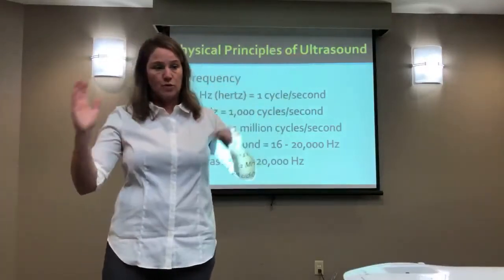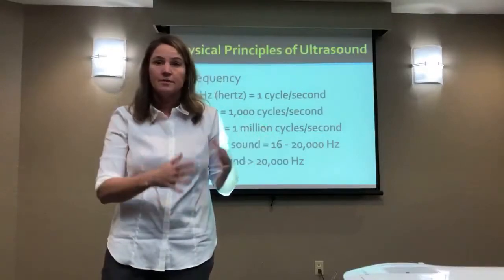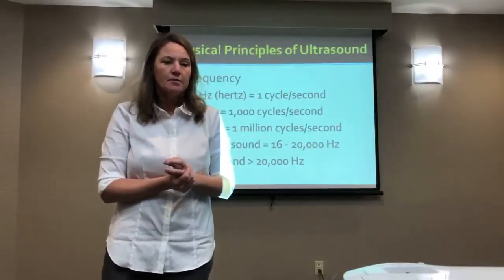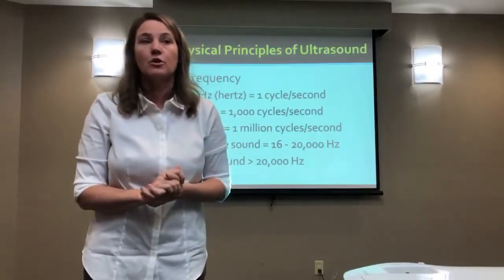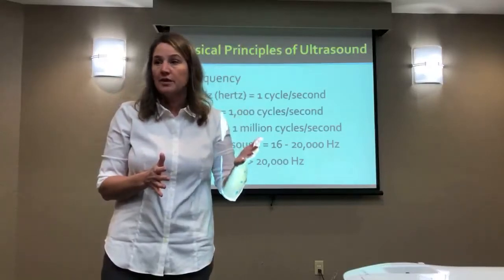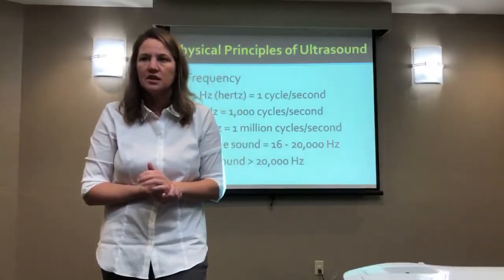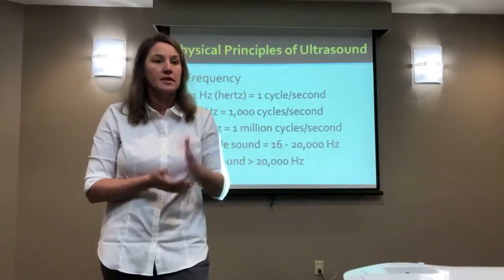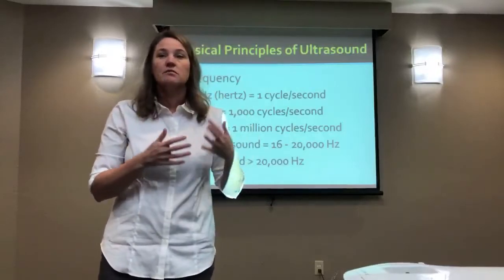So there's a long range. From 20,000 on up is classified as ultrasound. And there's a lot of different things that are done with it. We already talked about therapeutic versus diagnostic versus damaging type energy. So basically anything over 20,000 would be considered ultrasound. So there are devices that are often called low frequency ultrasound. They're in the thousands. So they're from 20,000 up to just below 1,000,000. If you do wound care, we talked about wound care a little bit this morning, there are devices such as the MIST, Sonica, I don't know if you've ever used any of those. They're used for wound bed debridement and stimulation. Those are in the low frequency range. So those are usually in the 20 to 25,000 frequency range, and they are therapeutic and they are useful.